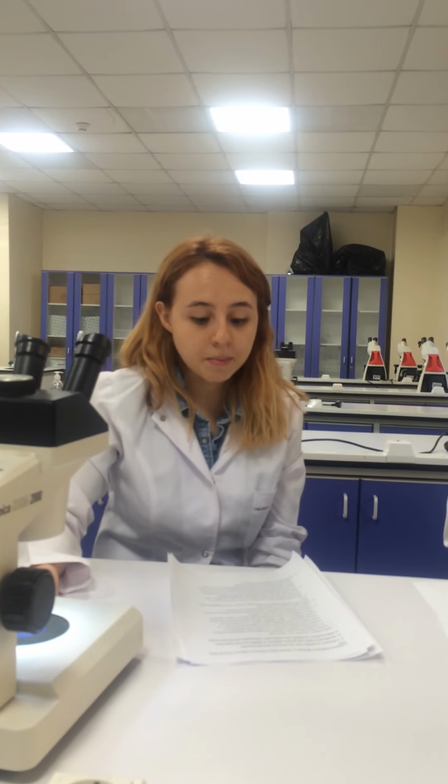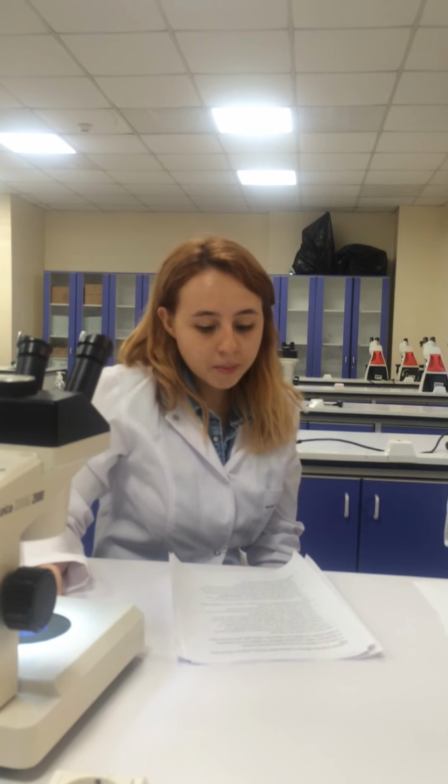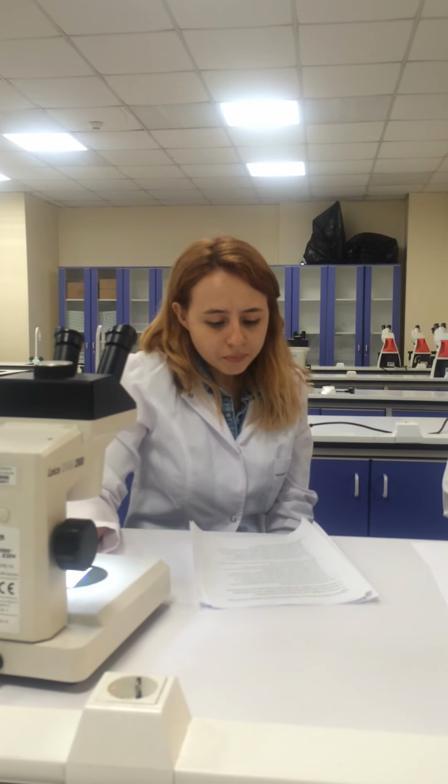For adipose induction medium, 1 liter of serum-free DMEM/F12 is prepared with antibiotics of 1% penicillin, streptomycin, and amphotericin B, containing the following: 1 milliliter insulin stock, 1 microliter T3 stock, 200 microliters transferrin stock, 100 microliters dexamethasone stock, and 100 microliters rosiglitazone stock.